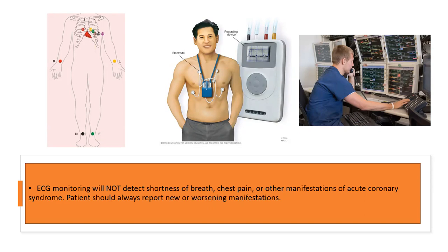We're just trying to see the electrical activity of what's going on with the heart, because if we're not beating appropriately, then we're not causing the contractions we need. The electrocardiogram is connected by wires, most of the time called leads, that are placed on skin electrodes, which are placed on the chest and limbs of the patient. These are our electrodes and these are our leads here.